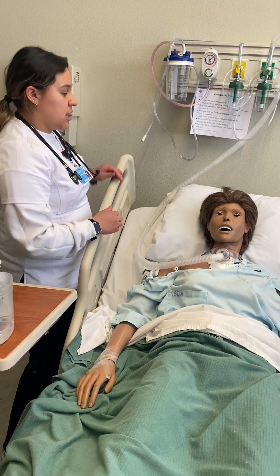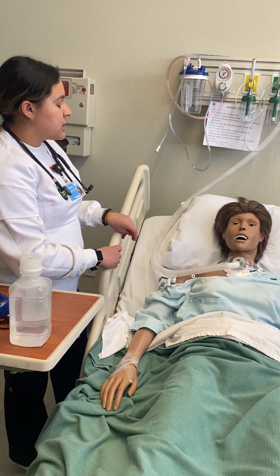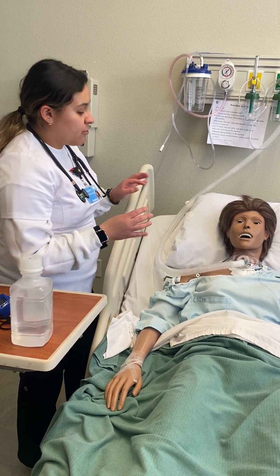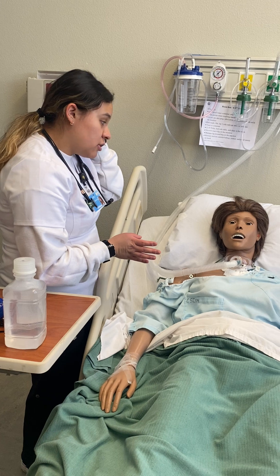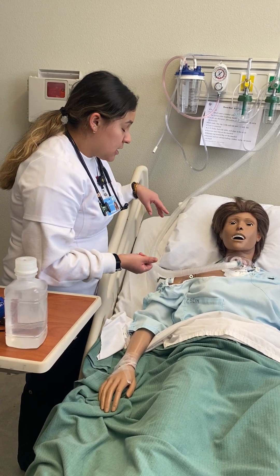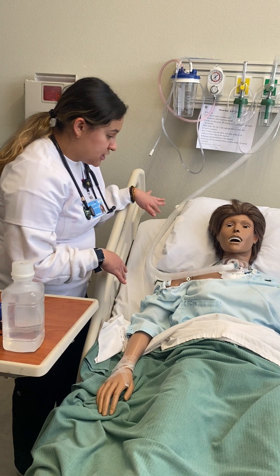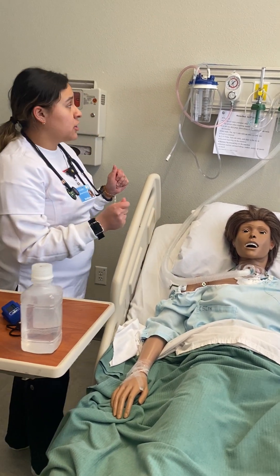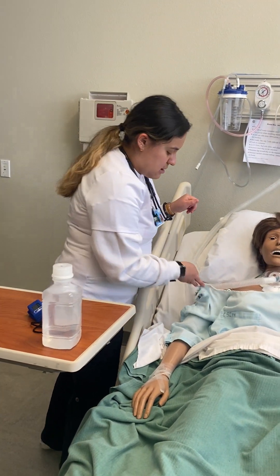Alrighty, perfect. So I have been told that you've been having some difficulty breathing. So first I'm going to perform an assessment. I'm going to make sure to hear your lung sounds, take your respirations, and then also see where you're sitting at with oxygen, and then we can perform some suctioning, okay? Okay. I'm going to go ahead and get prepared and then we'll continue, okay?